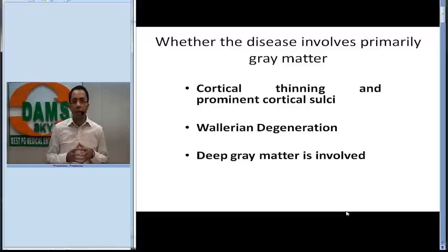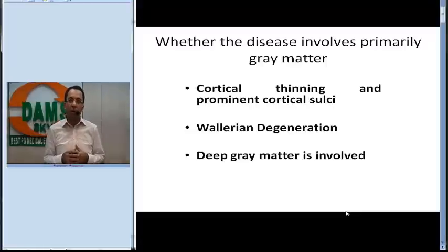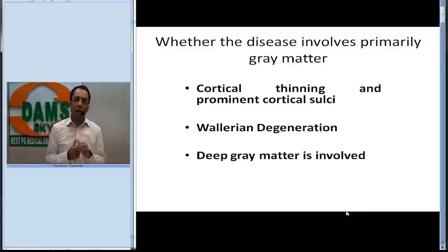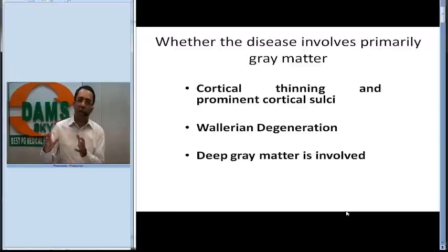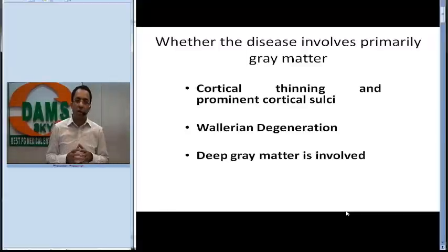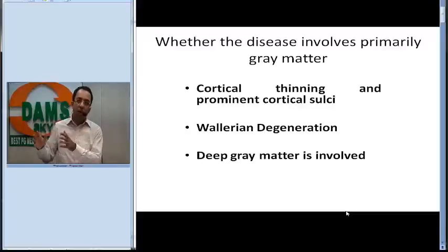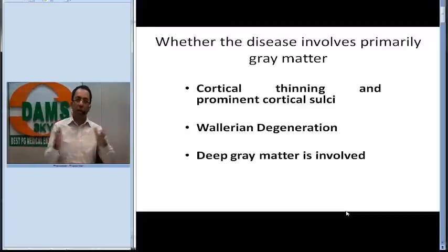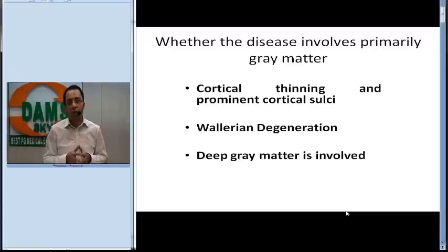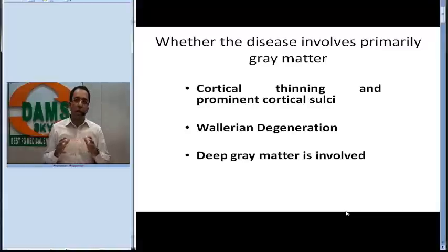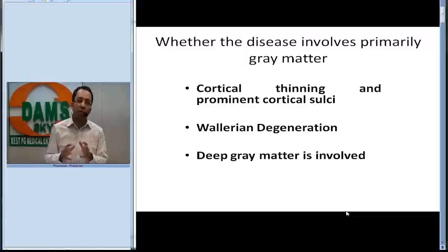The points that go in favor of a gray matter disease include cortical thinning, prominent cortical sulci, and white matter involvement due to Wallerian degeneration. A tricky point to understand is that in white matter disorders there is white matter involvement, but in gray matter disorders there is also white matter involvement due to Wallerian degeneration. To differentiate between the two, look at mass effect and volume loss — a white matter disorder would have some component of inflammation with maintained volume in the white matter.